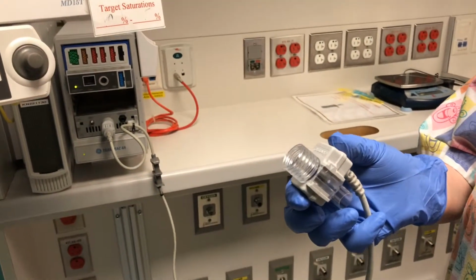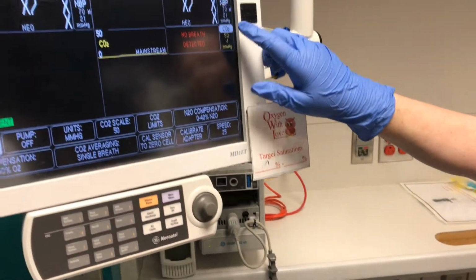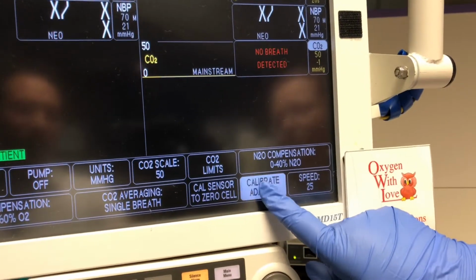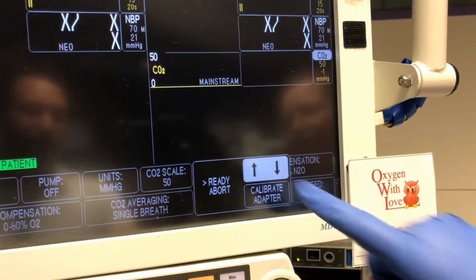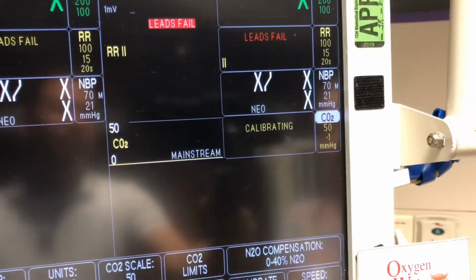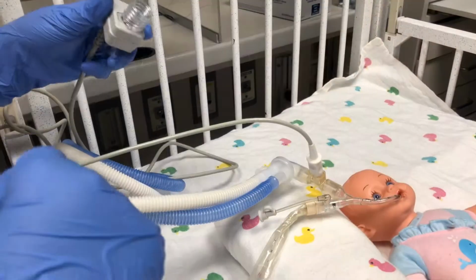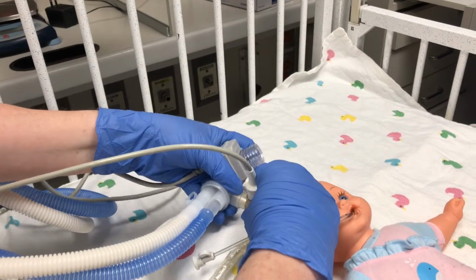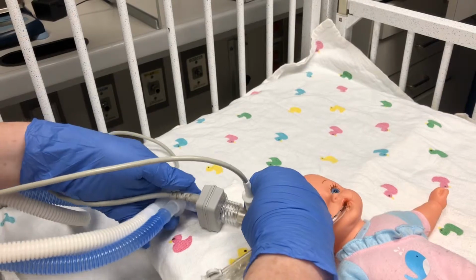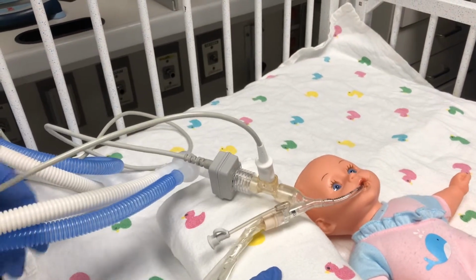So once a shift, you need to calibrate the adapter. In order to do that, over here on the monitor, you'll hit CO2, and then down here it says Calibrate Adapter. You're gonna press that once, and press that again. Once you've calibrated the adapter, you'll want to put it back in line with the circuit. And you just want to make sure each time that you have good support on this circuit, since it is heavier than what we normally have.